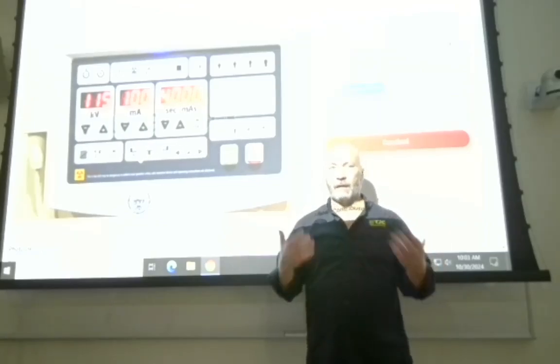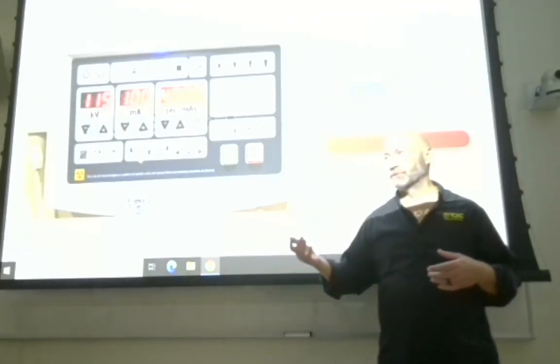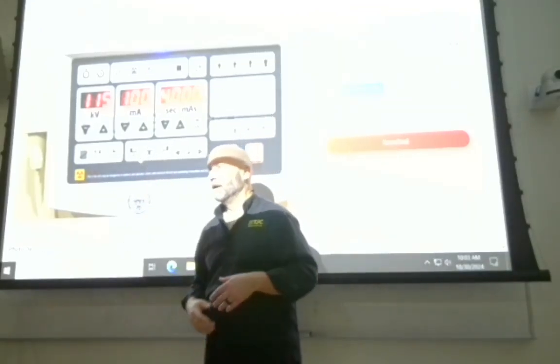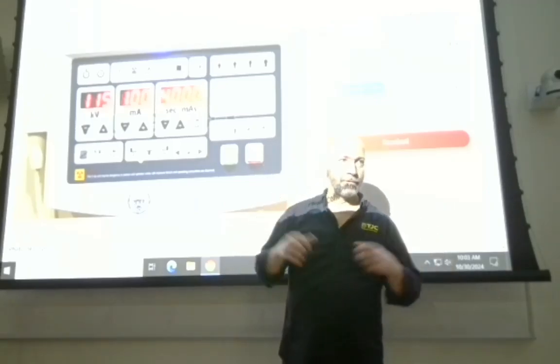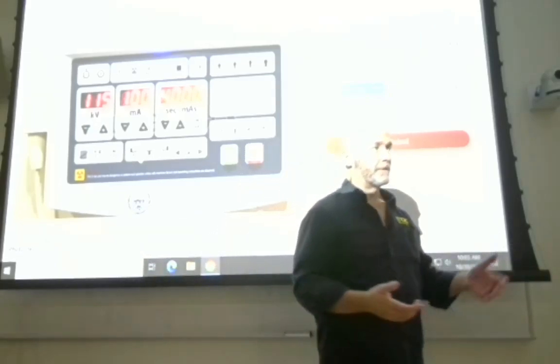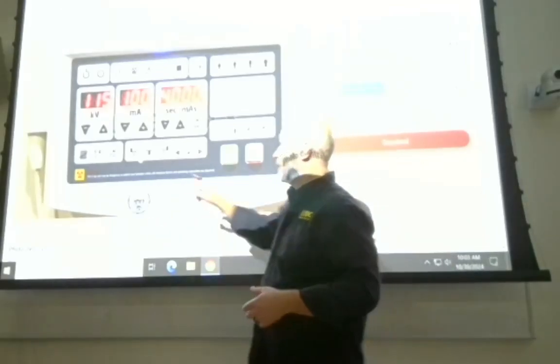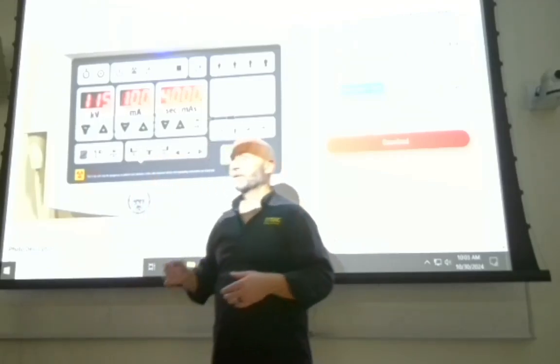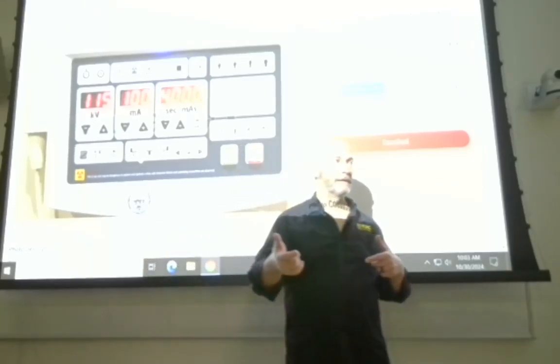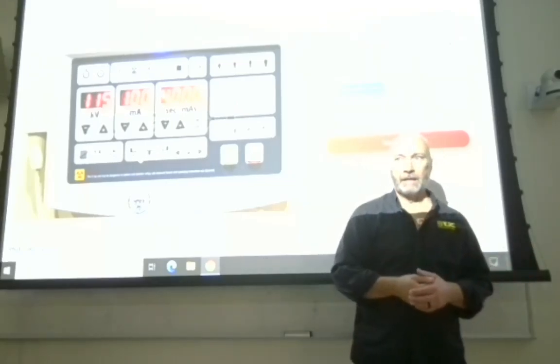Inside the wall bucky, what you have is radiation detectors in a couple of different formats that we'll talk about in a bit, but probably not until Wednesday of next week. Different types of radiation detectors, but what those are is what we refer to as phototimers. So we have a lot of different types of timers, and we're going to walk through each one of those, but we're going to talk about these specifically right now because it's in this chapter. What these are is just radiation detectors that are tied to a timer circuit, and it takes some of the guesswork out of selecting technique.